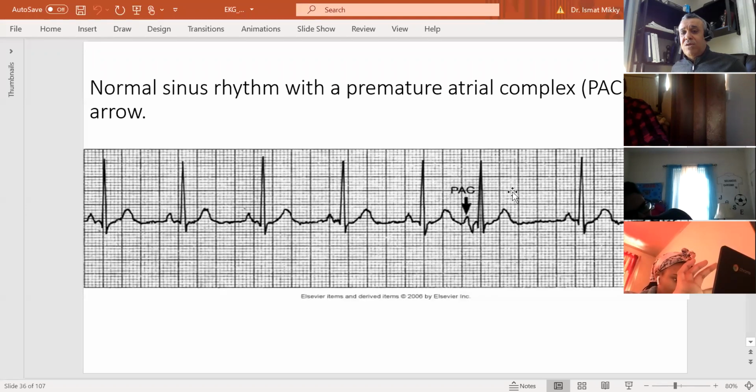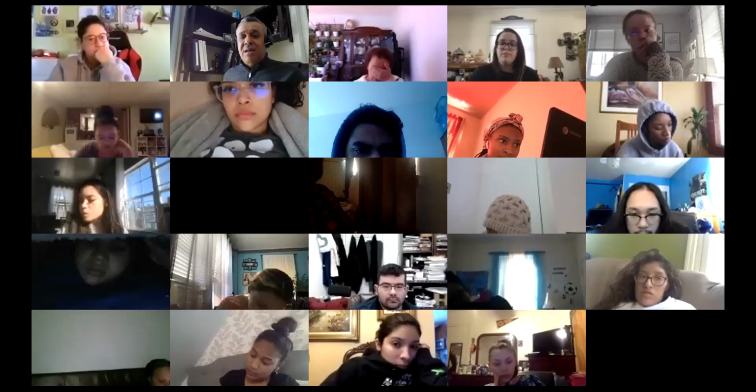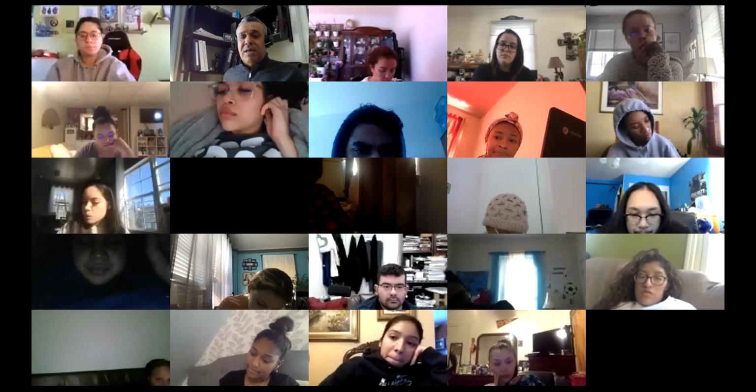We have now 1, 2, 3, 4, 5, almost 5.5 large boxes. So this is a compensatory pause for the myocardium and the conduction system to reset itself. And the same thing for the PVC, there is a compensatory pause. And then next week, we will continue with the EKG.